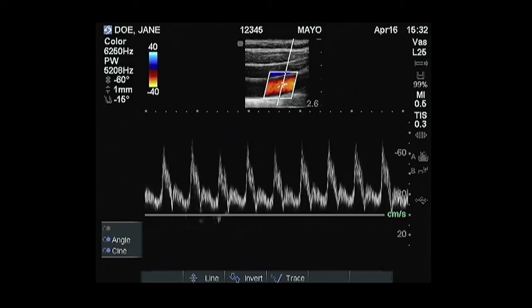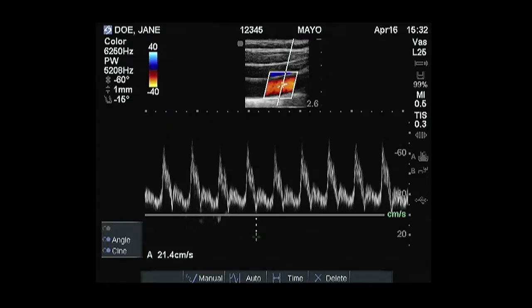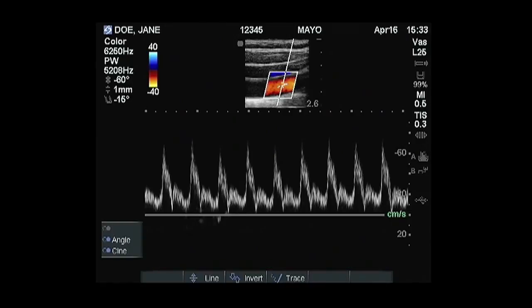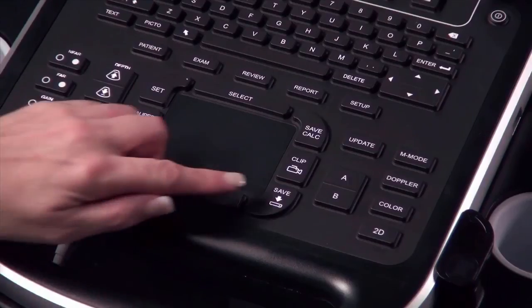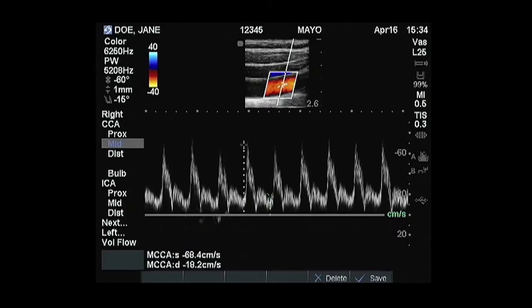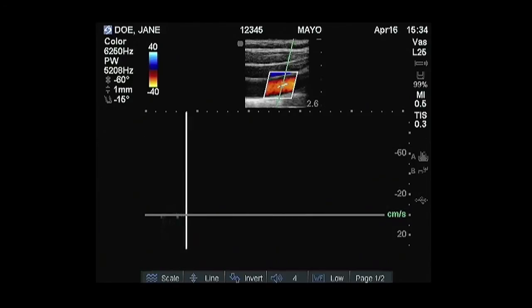Measurements may be performed on the Doppler spectral trace by selecting the Caliper key or Calcs menu key. If desired, press the Save key to save the image with the measurements displayed. Press the Freeze key to return to the live Doppler spectral trace, or press 2D imaging to exit pulsed wave Doppler.